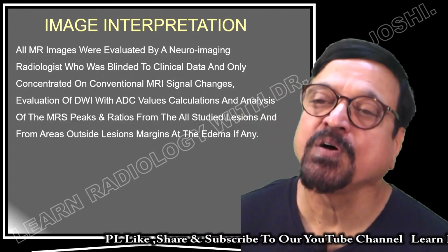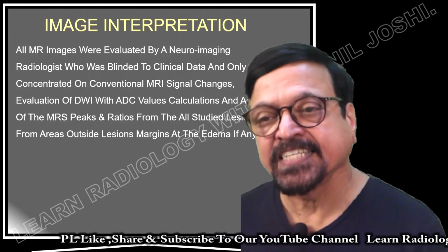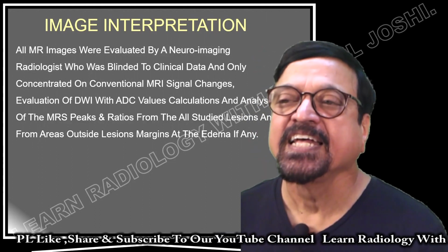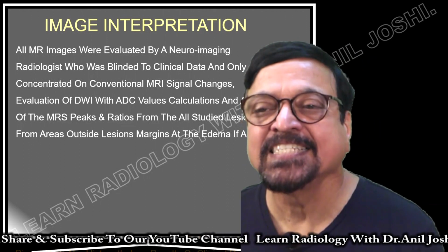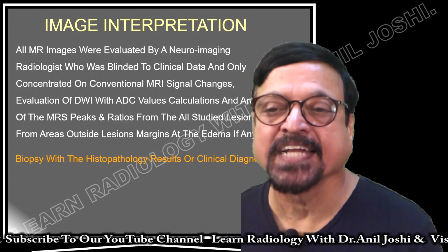Now evaluation of DWI with ADC values calculation and analysis of MRS peaks and ratios from the lesions and from the areas outside the lesion margins, at the edema, etc., is a technical skill and a technologist must know from where to take the readings.